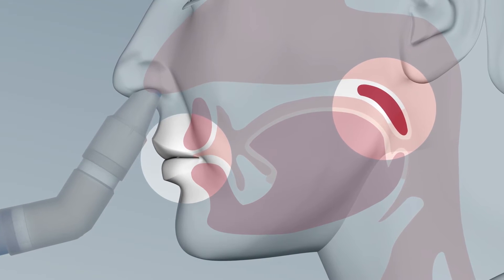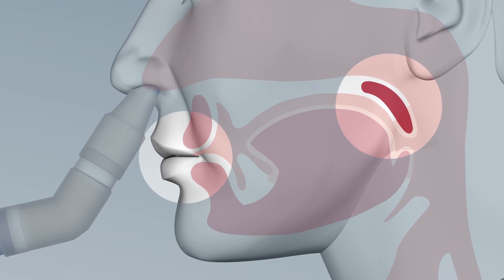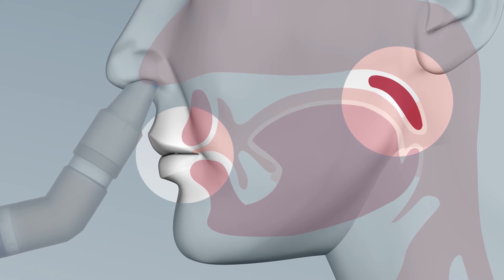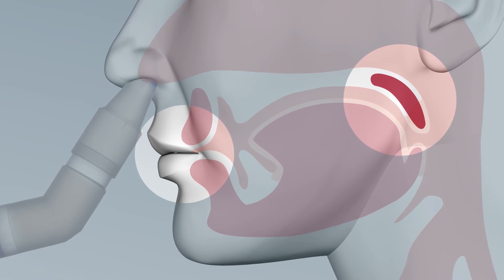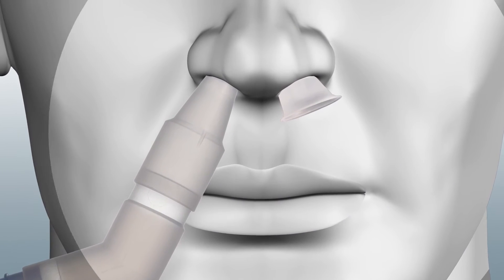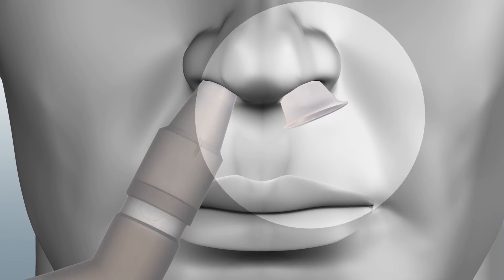It is important not to breathe through your nose when doing this. Getting this right can, however, take some practice. If your soft palate is closed properly, the sides of your nostrils will vibrate slightly and some air should come out through the hole in the nasal plug.